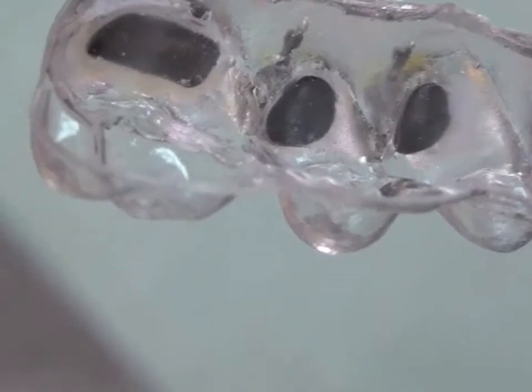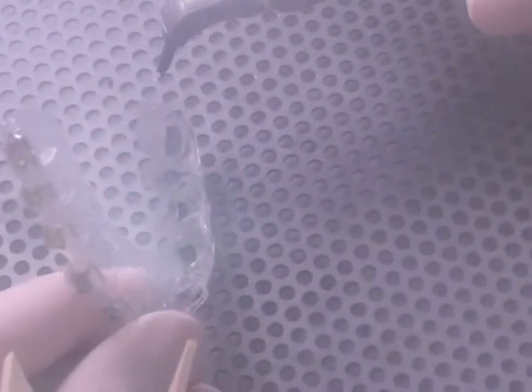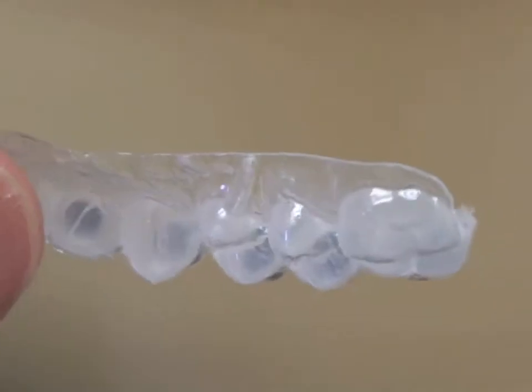We micro etch the custom base with SA85 abrasive powder. This removes model and separator residue yet does not remove the custom base of adhesive. After rinsing and drying, the brackets are ready for patient delivery.